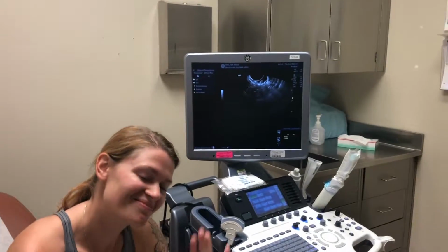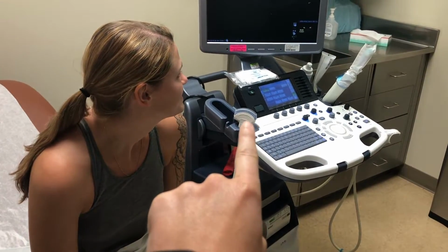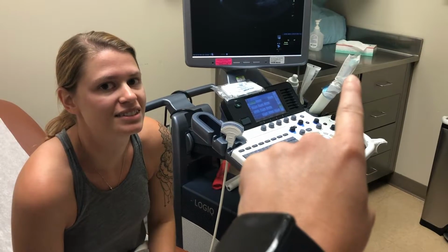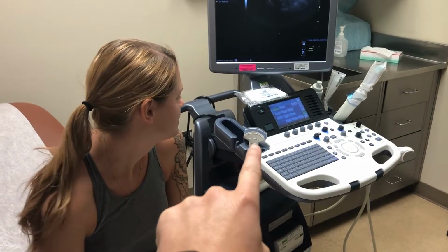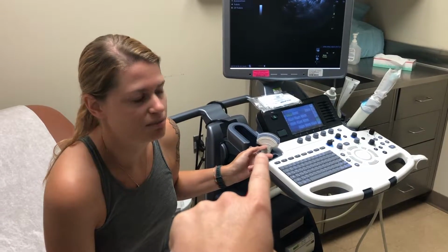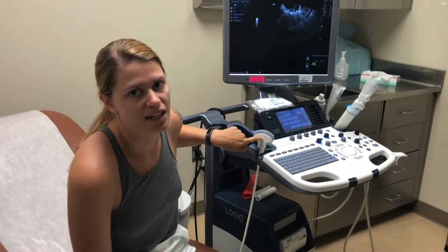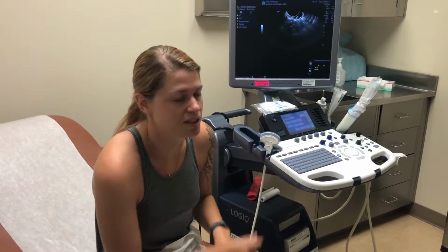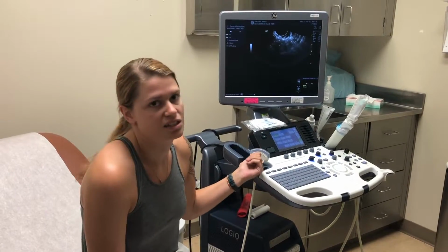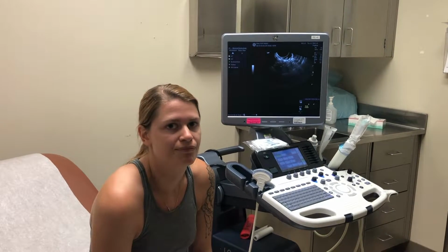How do you feel? There's a little machine that we're going to be using. Oh, they do it with that? Yeah. So that's how they check your egg? And that's how they'll check for a baby, if there's a fetus in there one day? They used this on my first insemination because they couldn't see my cervix with that one. So sometimes they use that to make sure the catheter's in the right place, but they don't use this for mid-cycle checks. Oh, okay. So this is for pregnancy then. Like after 8 weeks or something. It is the same machine for checking for babies?